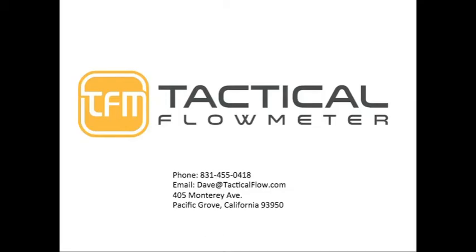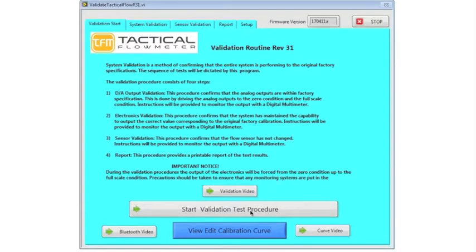Tactical flow meter. Once you start the program, you can choose between validation test procedure or view, edit, calibration curves. These are instructions, video instructions, one of them you're watching. View, edit, calibration curve. I'm going to click this.